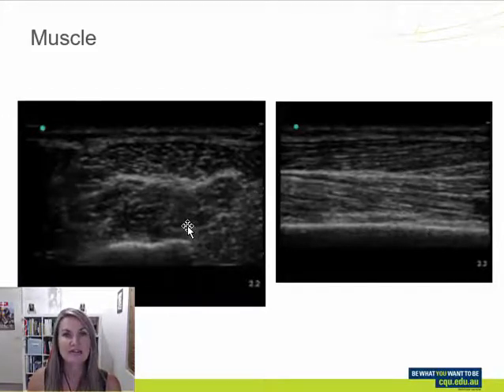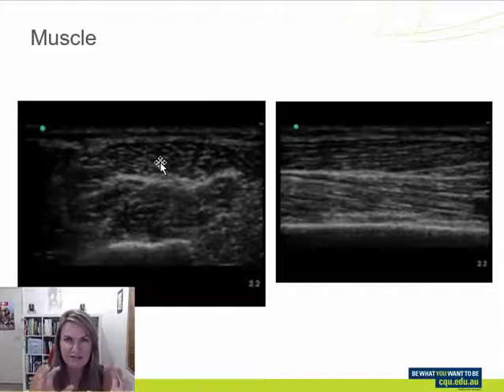Here we can see it in transverse. Here's the fascia cutting through here. So that's again echogenic, nice echogenic striations. And then these fibers that are lying horizontally here, we can see are rounded, so there you can actually appreciate all the little tiny fascicles, the bundles that build up a muscle, and what they look like.